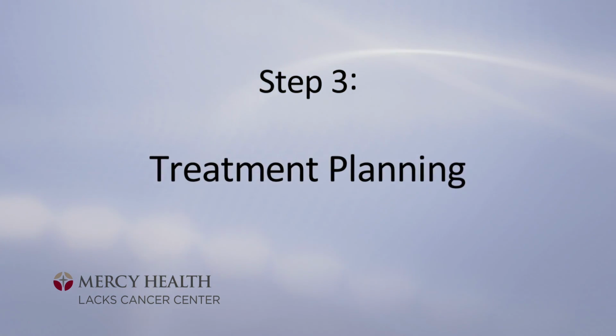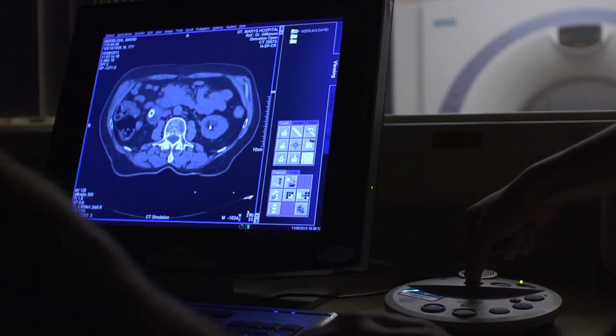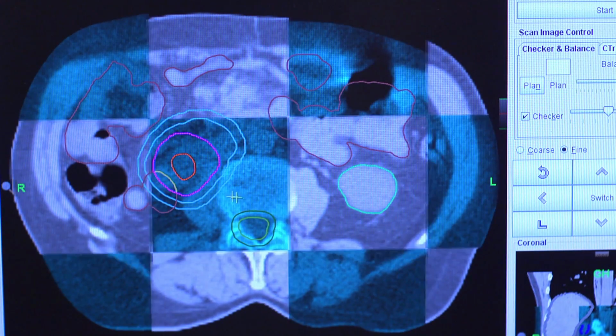There is a fair amount of work involved in designing a treatment plan that's specific for a patient. Every patient is different. The location of the disease in every patient is different. The surrounding normal tissues have to be protected. So designing a treatment takes quite a bit of work. It takes time to make use of the data that was taken with CTs, MRIs, PET units, etc.